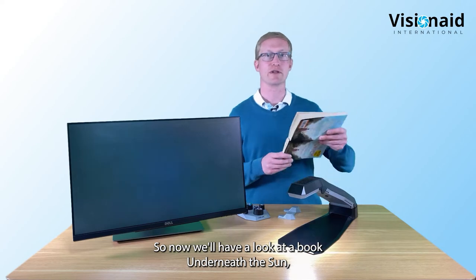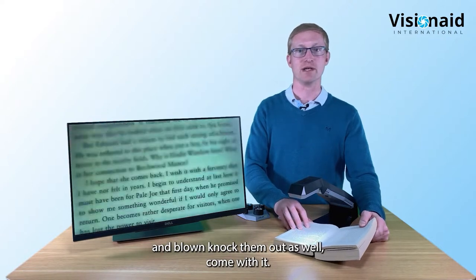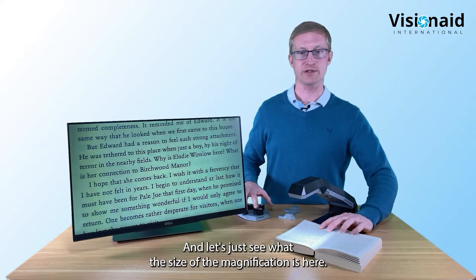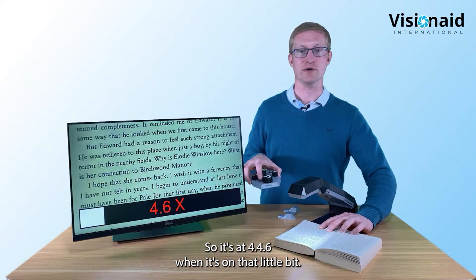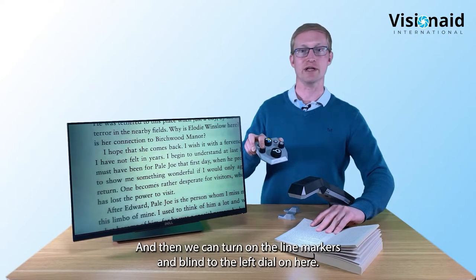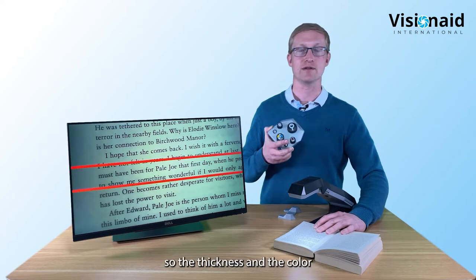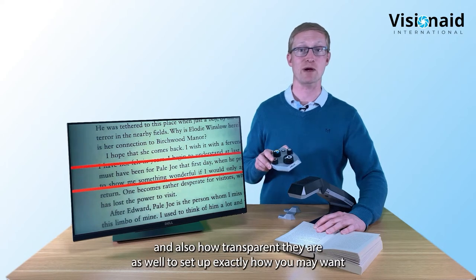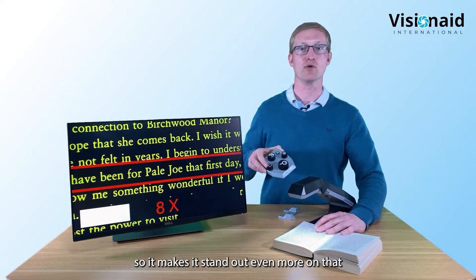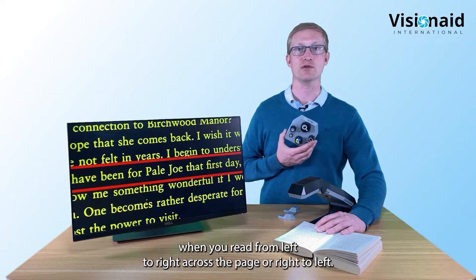Now we'll look at a standard paperback book and the line and blind marker modes. You can magnify the full width of a standard paperback novel. Clicking the left dial activates nice line guides across the screen. You can customize the thickness, color, and transparency of the guides. In two-color mode they stand out even more and help you track when reading from left to right - or right to left for Arabic.